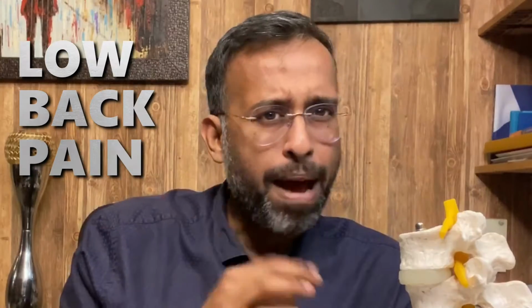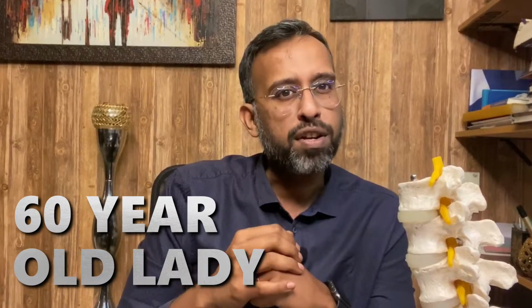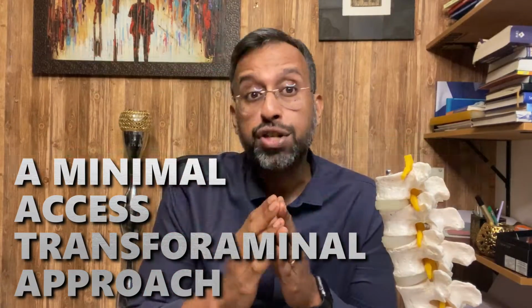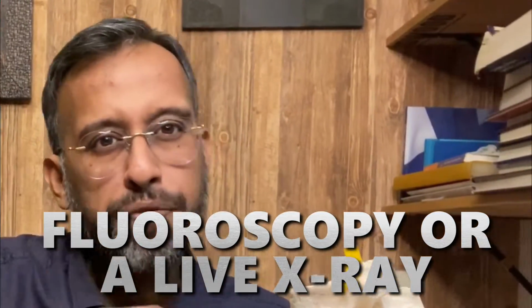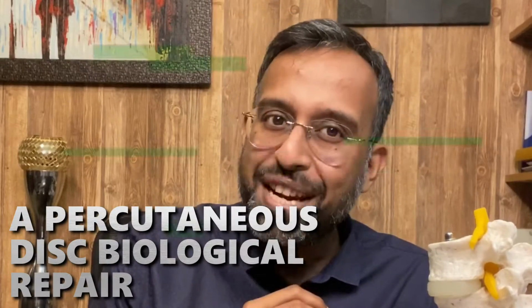Let's look at low back pain and how we are going to treat it today. A 60-year-old lady, obese with hypothyroidism, and hypothyroidism and obesity is a high risk for general anesthesia. We decided to do a minimal access transforaminal approach. Our medications, exercises, weight loss, strengthening your spine with physiotherapy. We use a fluoroscopy or a live x-ray to locate the position of the disc. This is a process which can be done without general anesthesia. Now, this is a percutaneous disc biological repair.